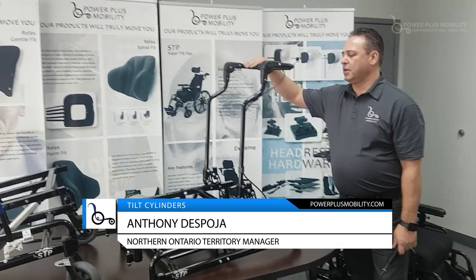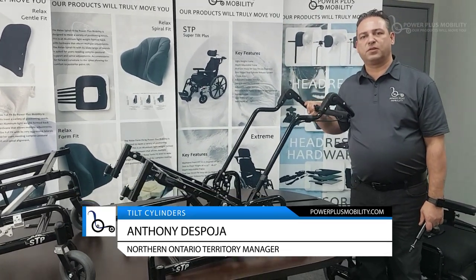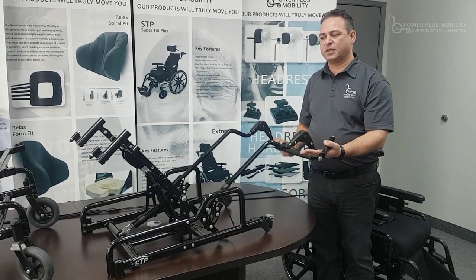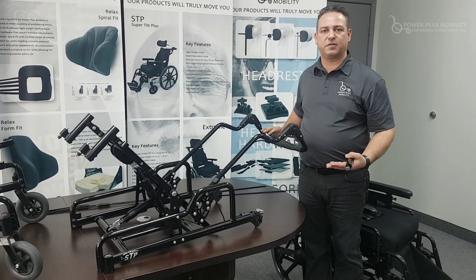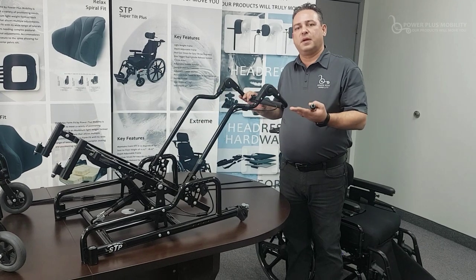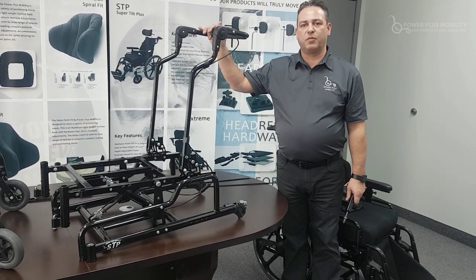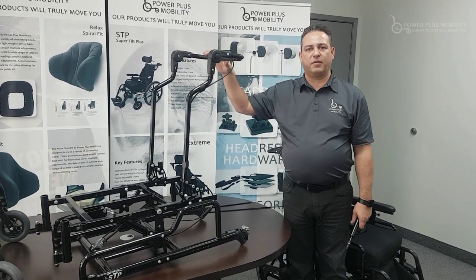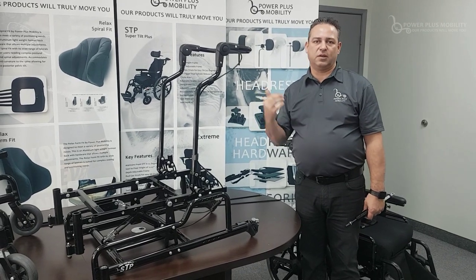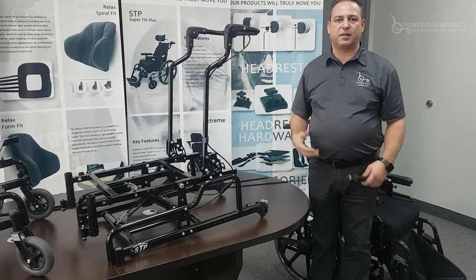When the client is coming down, there's a 200-pound cylinder of resistance that doesn't let them drop straight to the bottom — it gives them a smooth transition from 0 to 55 degrees of tilt. The 500-pound cylinder helps push the client up, allowing for smooth upward tilting momentum so a caregiver caring for multiple users has consistent tilt strength up and down.